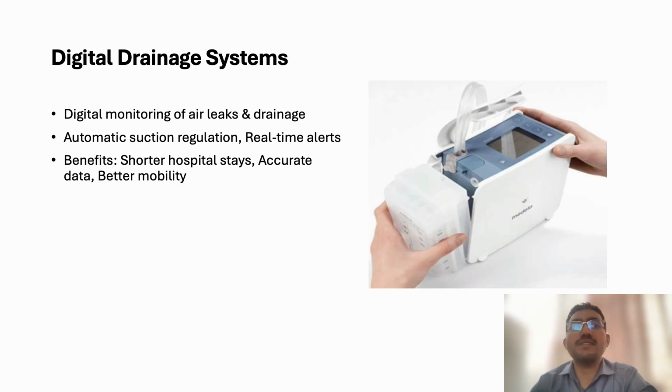Then there are various newer modalities, which are the digital drainage systems. Although we do not use these systems in our center, these digital devices measure the volume of air leaking through the system, and they also measure the volume of fluid escaping from the chest cavity. They also have automatic suction regulation, and they can give real-time alerts to the nursing and physician staff to monitor the quality and volume of the drainage.